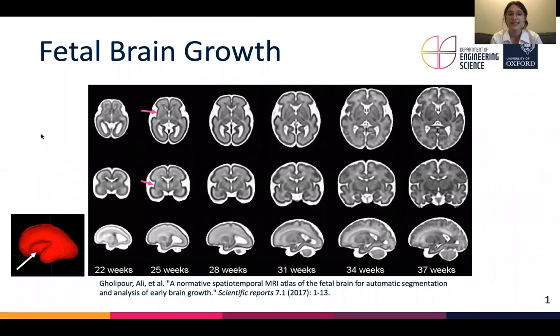The fetal brain begins to develop 13 days after conception. And one of the most striking changes is the transformation of a cortical surface, which goes from a smooth to a heavily folded surface under a process known as gyrification. Gyrification is found to be temporally consistent across the healthy population, with set landmarks appearing at set times.